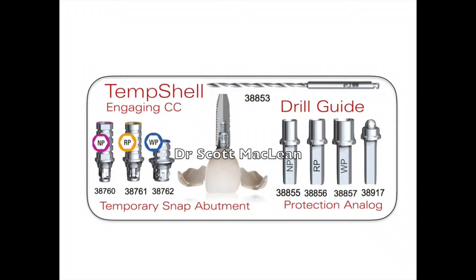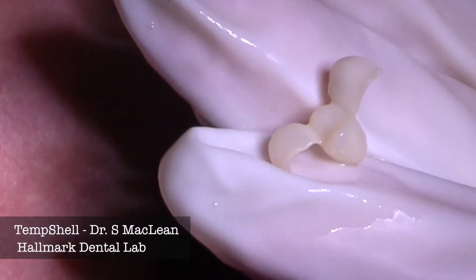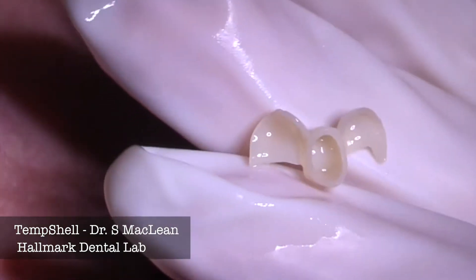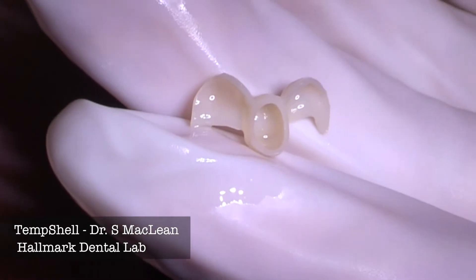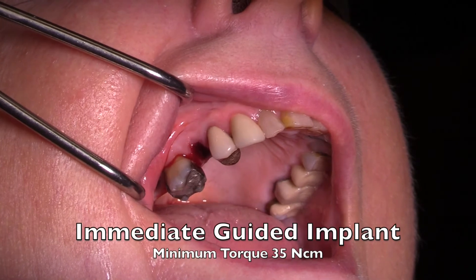There are a number of components you can use to do this — they're all listed right here. The temshell comes back, and this one was made by Hallmark Dental Lab. You can see it has two wings to wrap around the adjacent teeth where the implant has been placed. Once the tooth has been extracted, we use this guided surgery to place the implant, then the temshell is tried in place to see where everything is going to be fabricated.